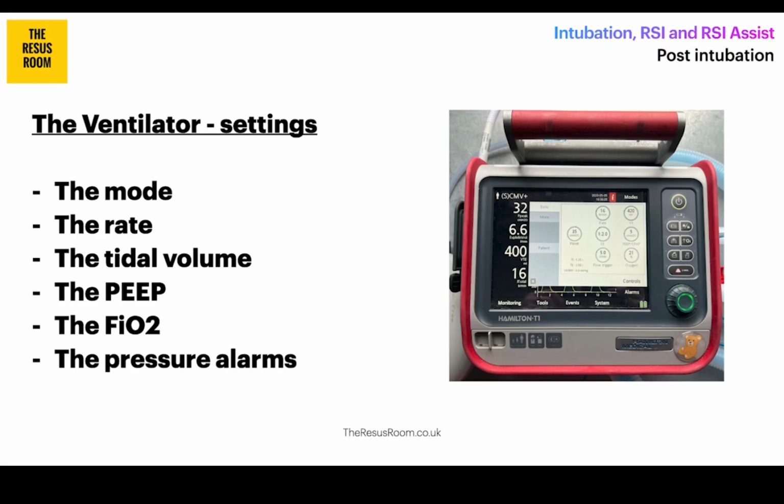And in very simplistic terms, that means during volume controlled, the ventilator will deliver a set tidal volume using whatever pressure is needed to reach that setting, although you can also add a pressure limit on most modern machines. During pressure controlled ventilation, the ventilator delivers a flow to maintain a set pressure at a set respiratory rate over a set inspiratory time, which also needs to be set.